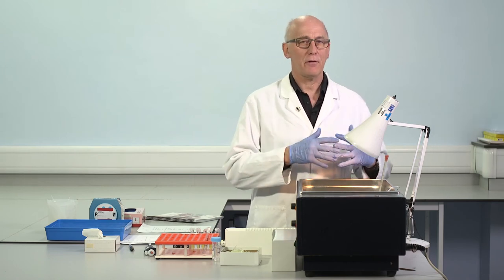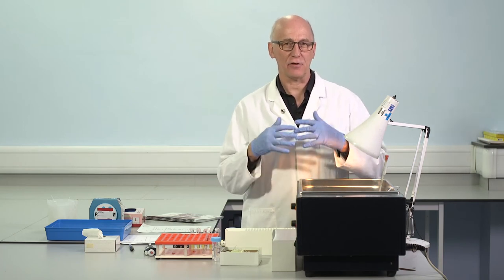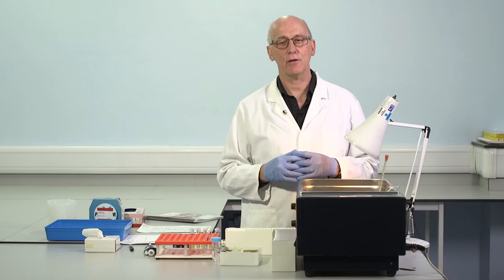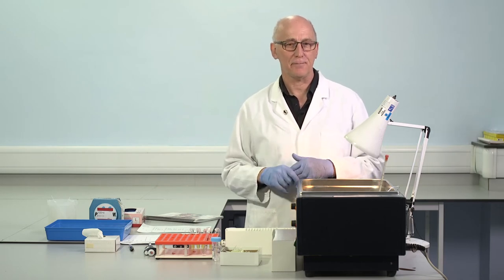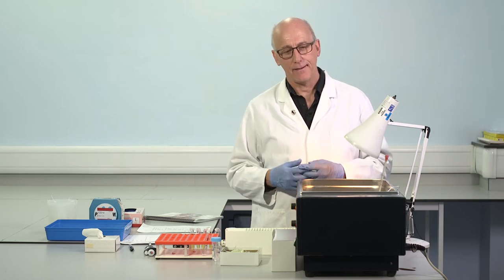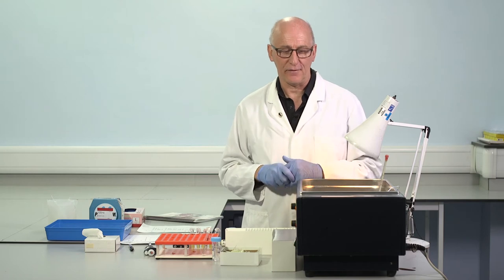We use the mean value plus 2 standard deviations of the results as an upper limit, mean plus 2 standard deviations, and we use the mean minus two standard deviations as the lower limit. And again, this approach is described in the laboratory manual, so we'd refer you to that for the fine detail.